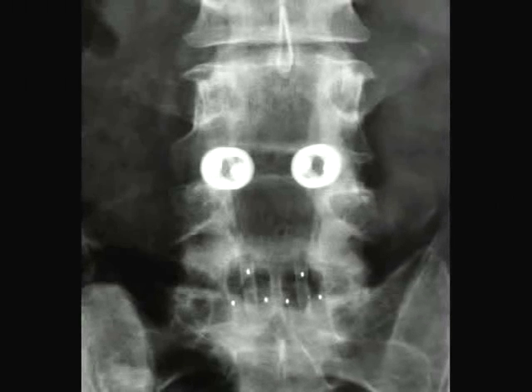This is a patient who underwent a BAK interbody fusion at the L4-5 level, demonstrating the white cages at the L4-5 level, and at the level below, the white markers demonstrating the implant with visible bone fusion between the L5-S1 level that can be seen. With this fusion device at the L5-S1 level, it's easier to see bone formation than it is through the BAK cages.